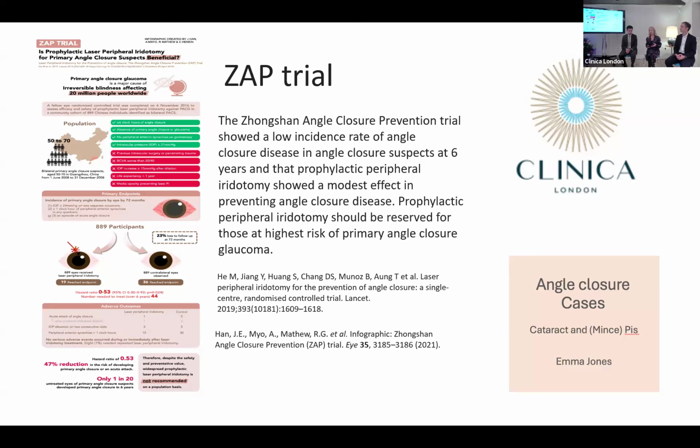And you would do a gonioscopy beforehand. And usually you can get a view of the nerve. If you saw they had hideous glaucoma, high pressure, or a really terrible looking drainage channel, then you're going to wait and do an iridotomy, and probably do a B scan first to see if you can see a tear. Optos as well, you can often get a good view, Optos and a B scan. But usually you can dilate people. It's very rare that we wouldn't dilate them.